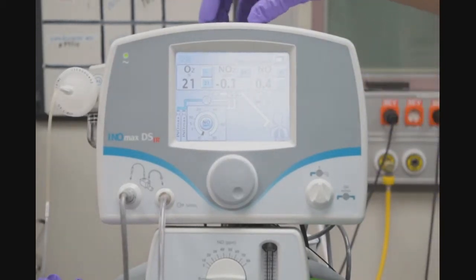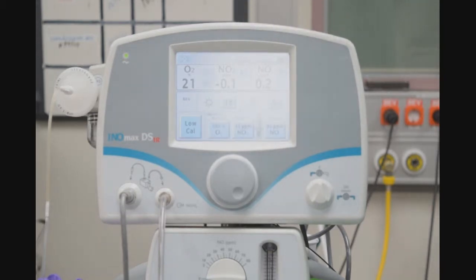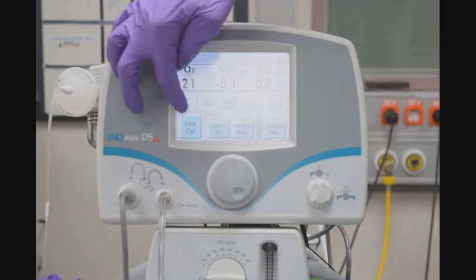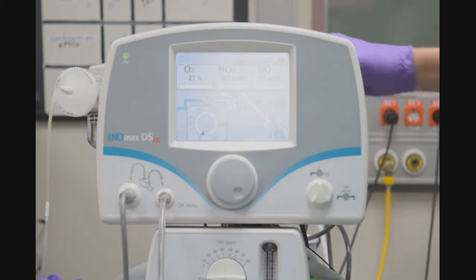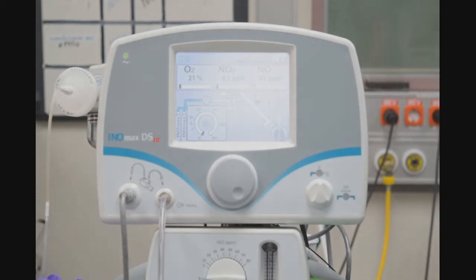To get into the low-range calibration, I will select the top right button on the screen. Select low-range calibration, and the low-range calibration light will flash on the right side of the screen — I will select that. At this point, it takes about three minutes for it to calibrate. Once it calibrates, we'll proceed on.